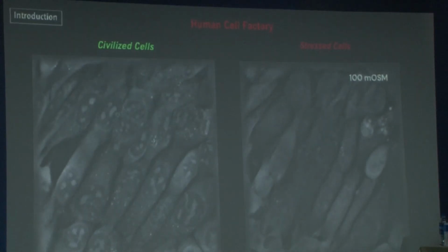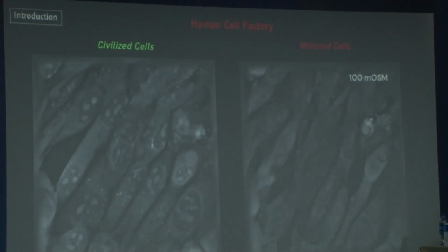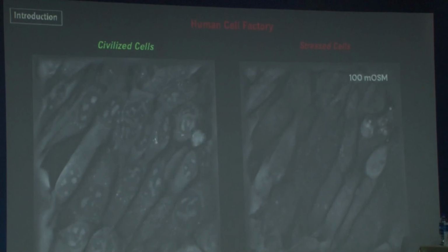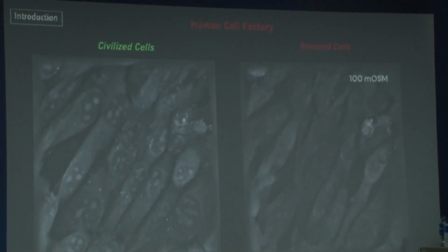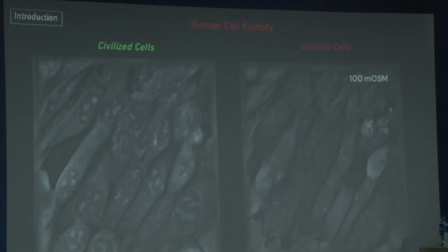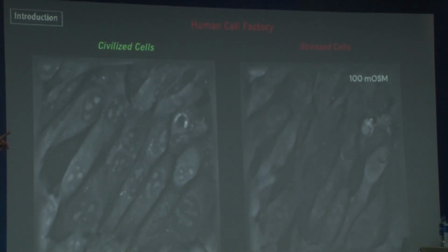Now, biomarkers. Biomarkers are nothing but the inflammatory cells which are there on the surface of your eye. Now, if you see these two videos, the left side and the right side, just concentrate on this area. When I put the cursor, it will go away, but I just want to then move it here and this area, okay? So you can see that one cell is being engulfed by the other cell and it's being eaten away. And on the other side, you see that the cell is just there.